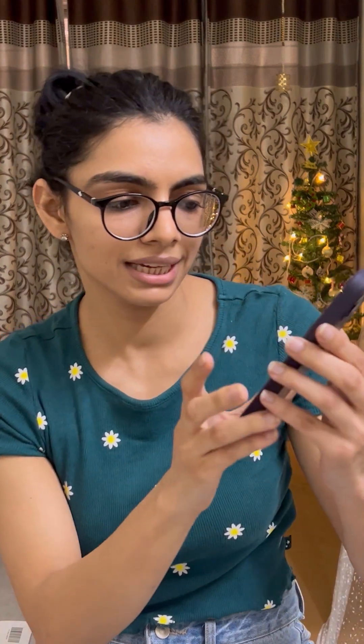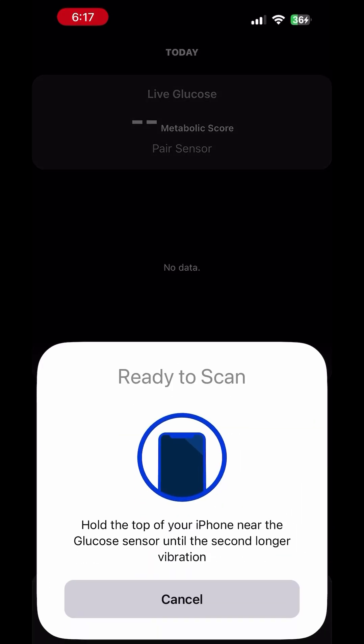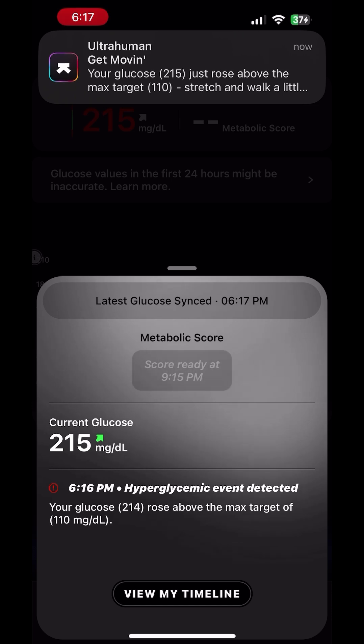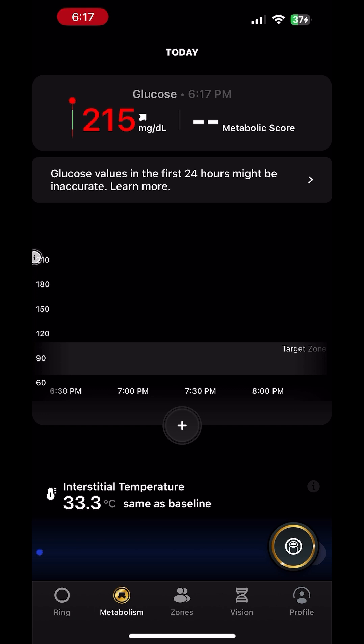The scan is complete. Once the scan is complete, you will see a timer of 60 minutes, after which the sensor will be ready. After 60 minutes, the sensor is ready and you can scan it by putting the phone on top of your sensor to check the readings. I hope this video helps you in checking and controlling your blood sugar levels. Thank you so much for watching.